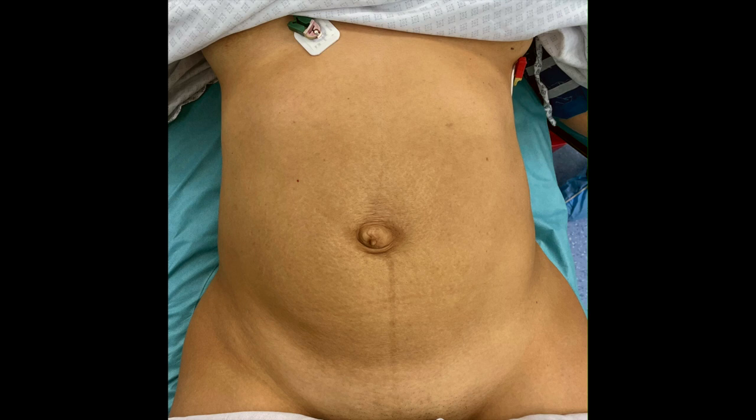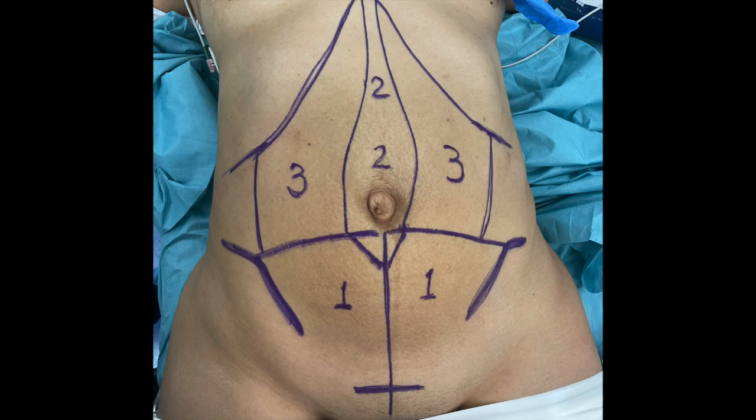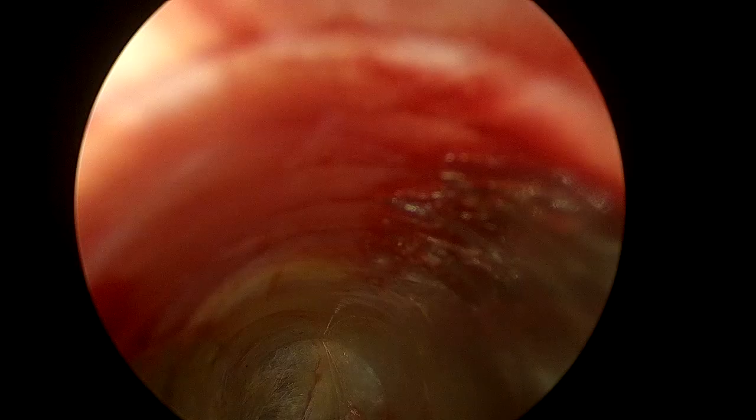This is the patient. She had a 3 cm umbilical hernia and a very symptomatic diastasis. We did a pure suprapubic incision in the midline with a 10 mm trocar and blunt dissection, just like you've seen me do in previous cases.